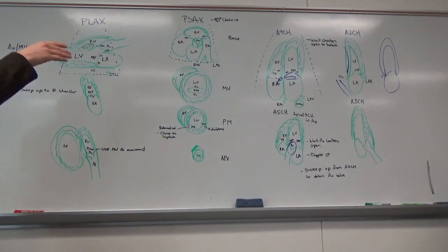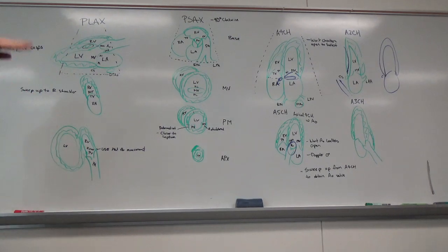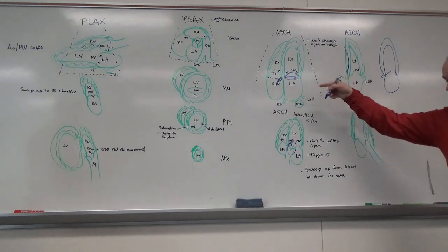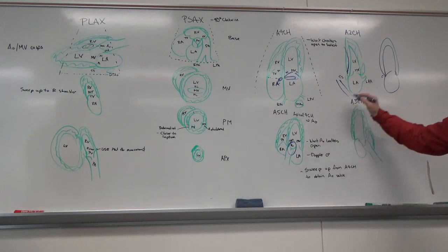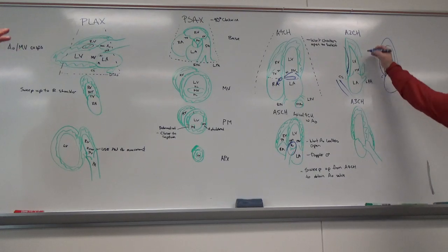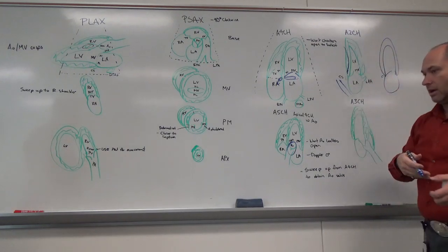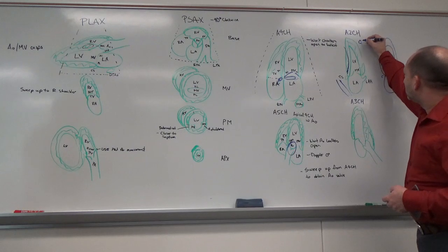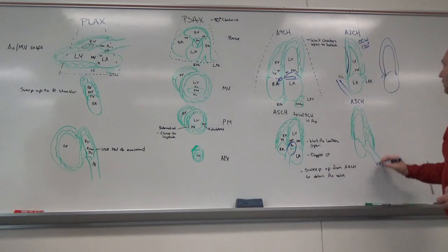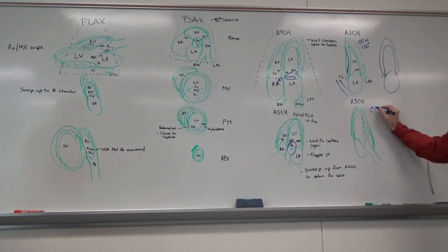From the 4-chamber, you sweep up to the 5, then you go back to the 4-chamber? Yeah, to get to these views, you want to go back to the 4 because that's where you're most central. If I go off the 5, I'm going to lose some of this other information. And then is it counterclockwise rotation? So this is counterclockwise, and it's 120 degrees. And then this is another counterclockwise.